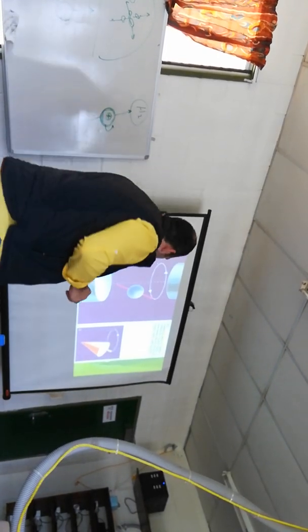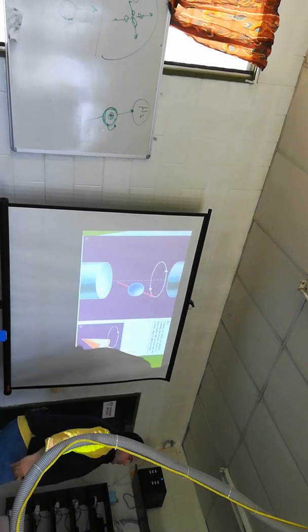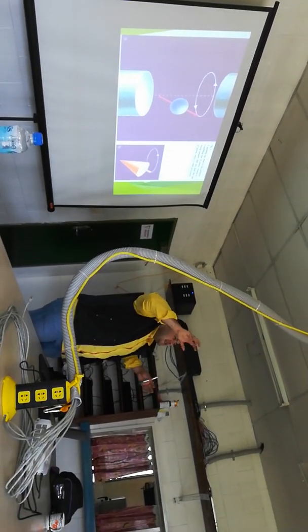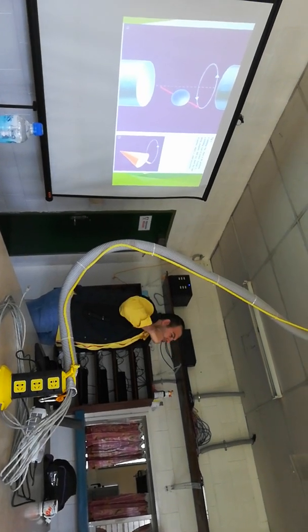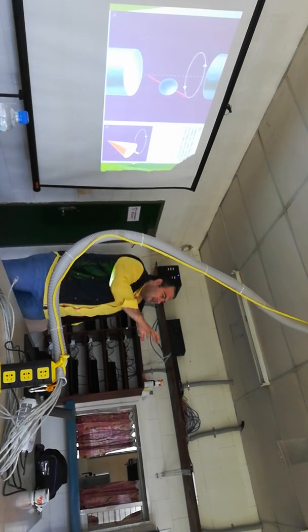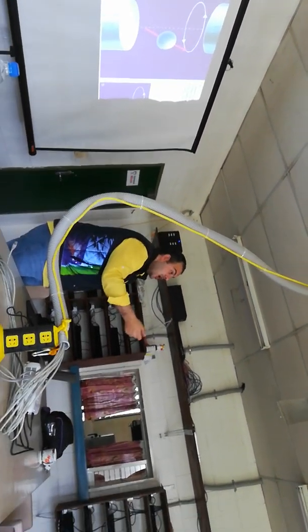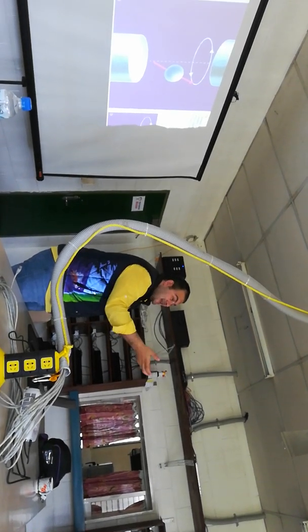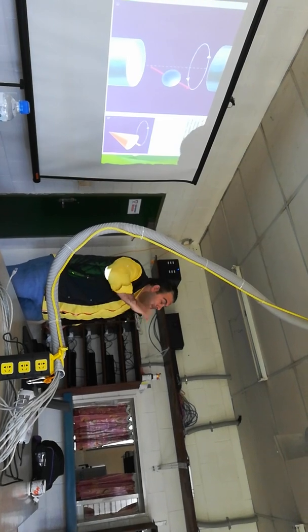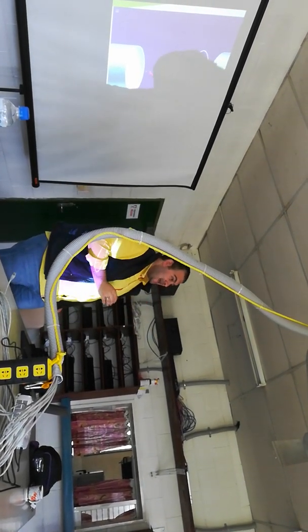So now, a million pointing up, a million protons pointing down, neglect each other. So I have 7 protons. These 7 protons enable me to get the image. Easy. Now we will excite these 7 protons. Now we will give them energy, radio waves, and the 7 protons will acquire this energy and will be transformed from a relaxed state to an excited state.